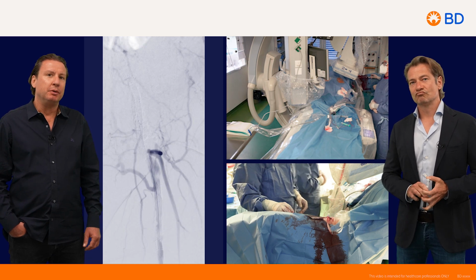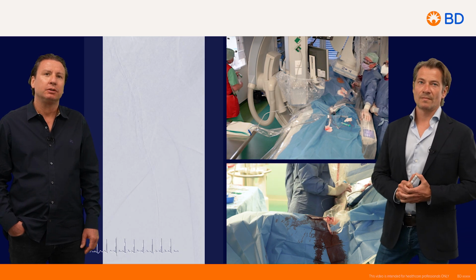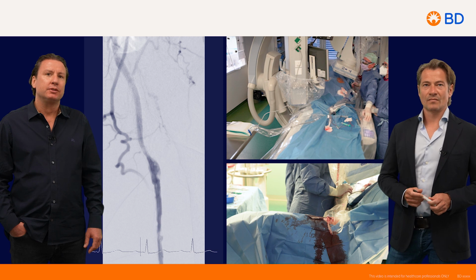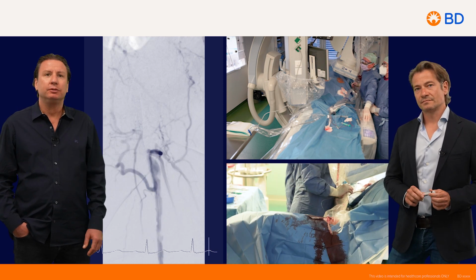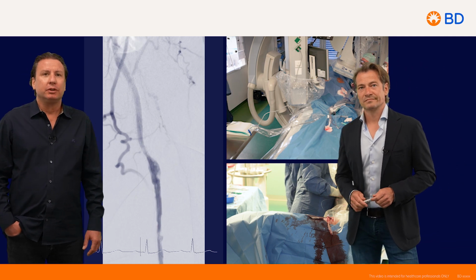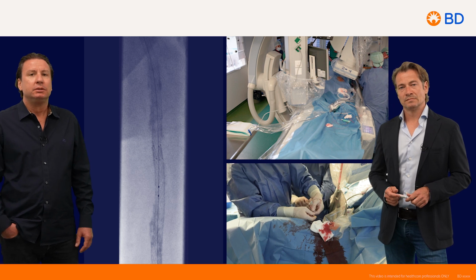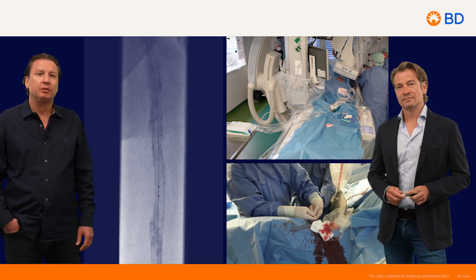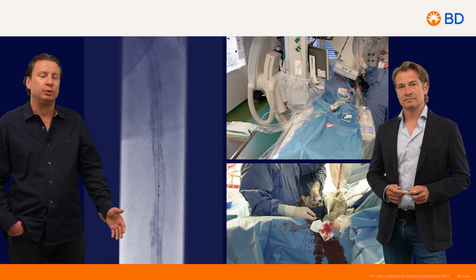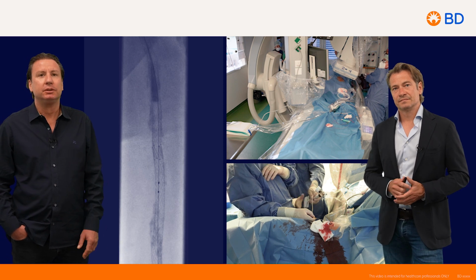There's still some remaining stenosis here in the common femoral in-stent. But you can see here that the SFA itself already has a nice lumen again and a good flow. And again here after debulking with the Rotarex, next step, again, DCB as usual. Sometimes with the DCB, because the shaft length here is 130, you might not reach the very distal portion of the SFA.